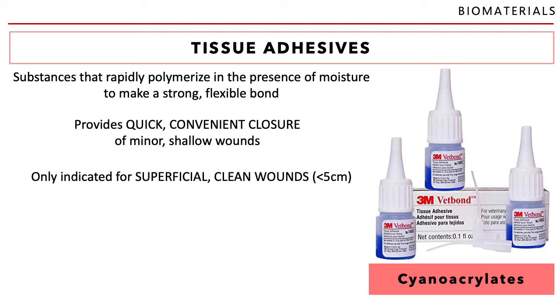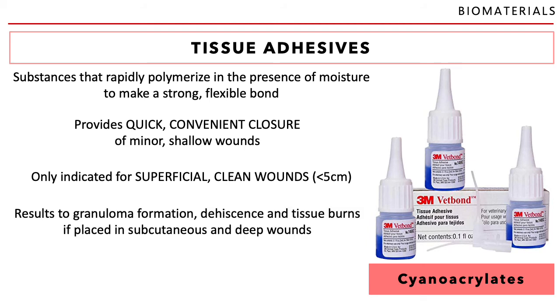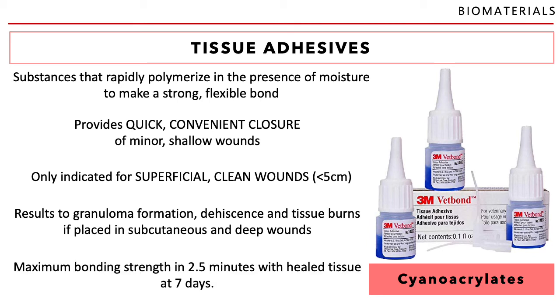If this gets in contact with deeper tissues, this can cause granuloma formation, dehiscence, and tissue burns. So ideally, what I do with this one is just use it on the side. I do not really put it on top of the wound. You could expect it to be done in 2.5 minutes, with healed tissue at 7 days.